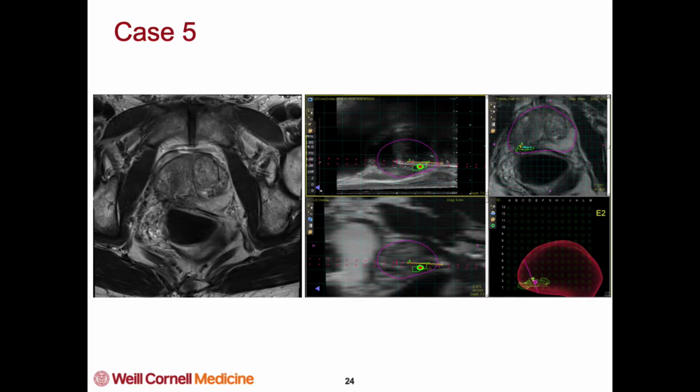Can you just tell us what's the difference between that focal therapy and HIFU? So the difference between this and HIFU outside of the MR gantry is that it basically uses ultrasound to guide the ablation. With this in the MRI machine, you're still using HIFU, but you're using MR thermometry to do your planning and then get feedback with regards to the ablation.